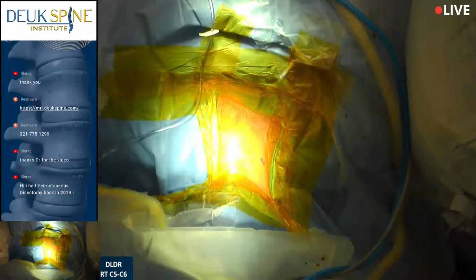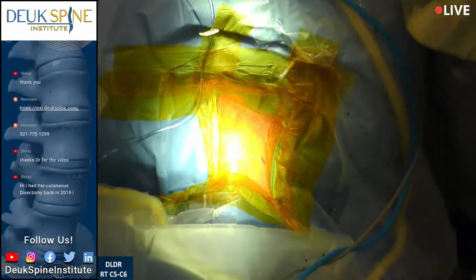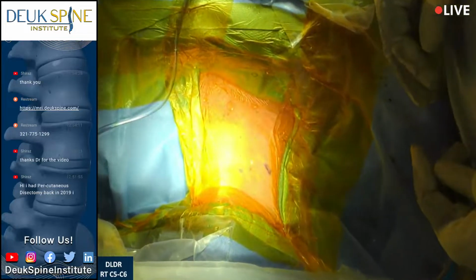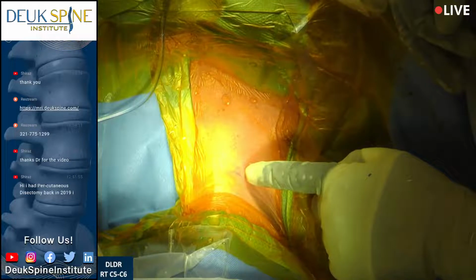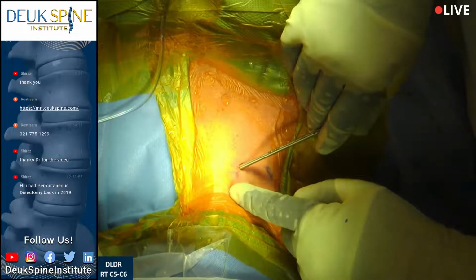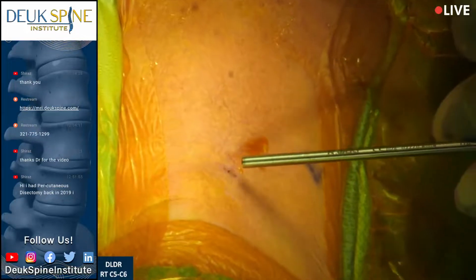All right, we're done. We took the tube out, and can you see the incision, folks? Can you see it, Henry? I believe we can, yes. It's right there. Here was the tube. That's the hole, literally right there. You guys see that? 4 millimeters, just big enough to fit the tube.